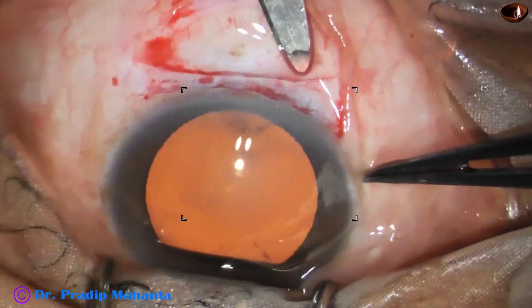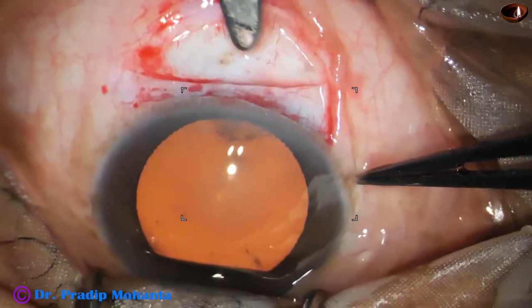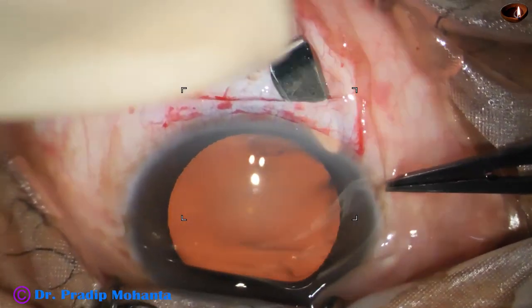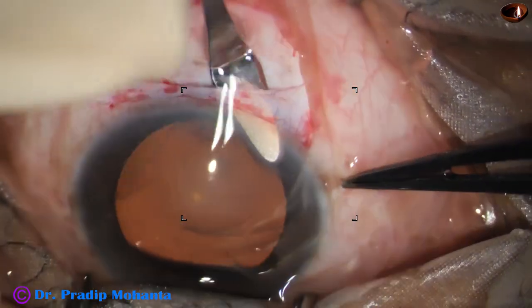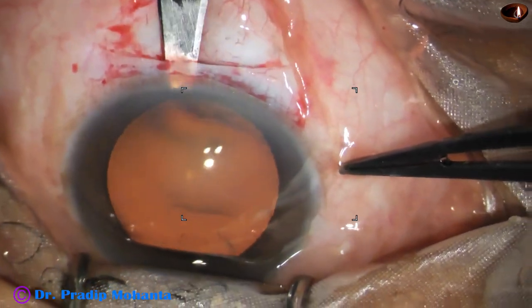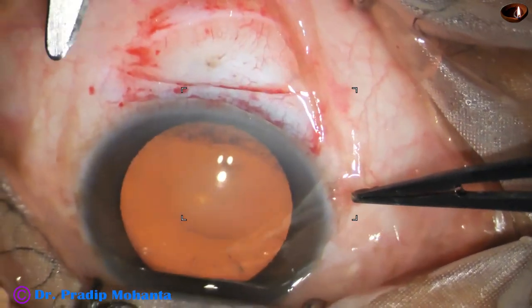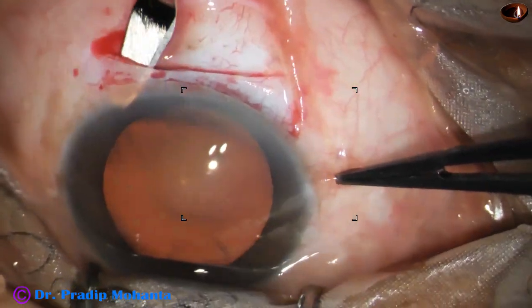Almost half thickness of the sclera has been incised. Now this crescent blade goes forward into clear cornea, being swept backward and to the left to get the left side of the sclerocorneal tunnel. The contour of the eyeball must be remembered. The inner opening of the tunnel is larger than the outer opening — the outer opening is about 7 millimeters and the inner opening is about 8.5 or 9 millimeters.